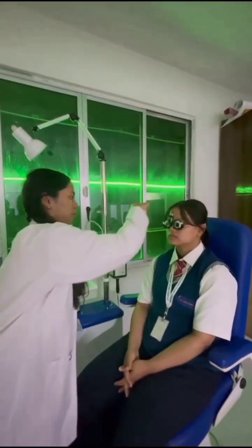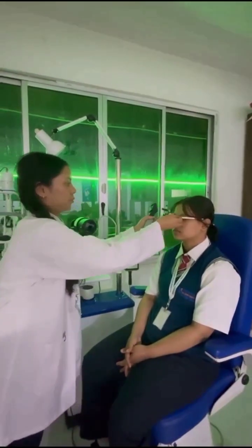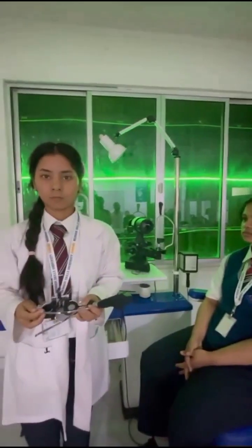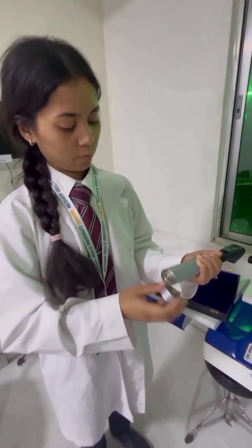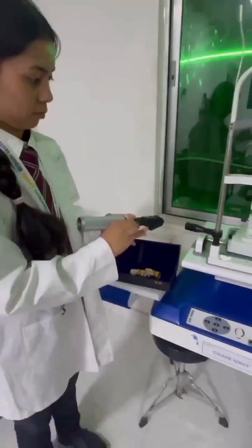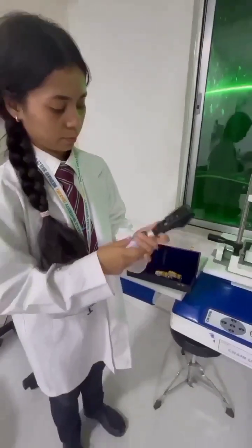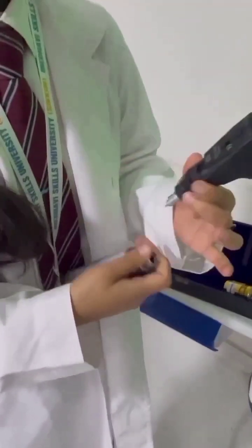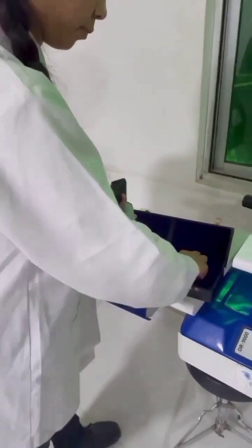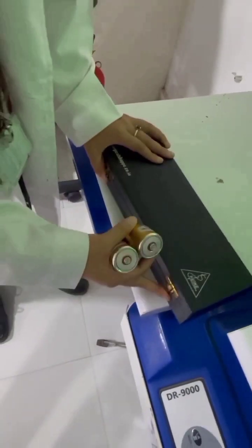So now I'm removing the lenses and the trial frame also. After that we have to remove the battery, and we have to detach these two parts and separate them, and we have to put this retinoscope into the box, and that's it.